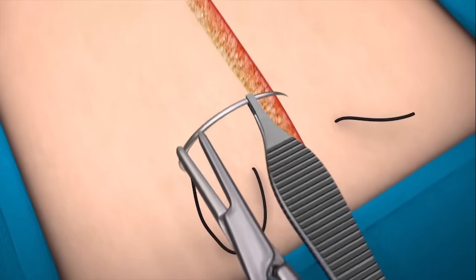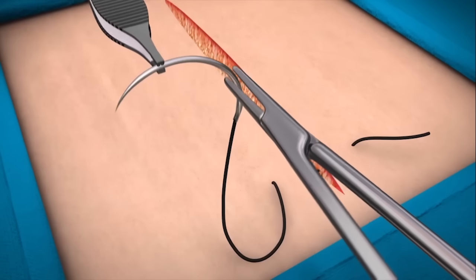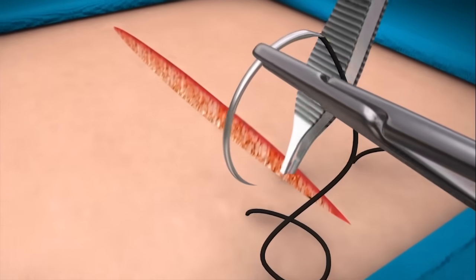Hold the needle with the forceps and rotate it in the needle holder to prepare for the backhand part of the mattress suture.